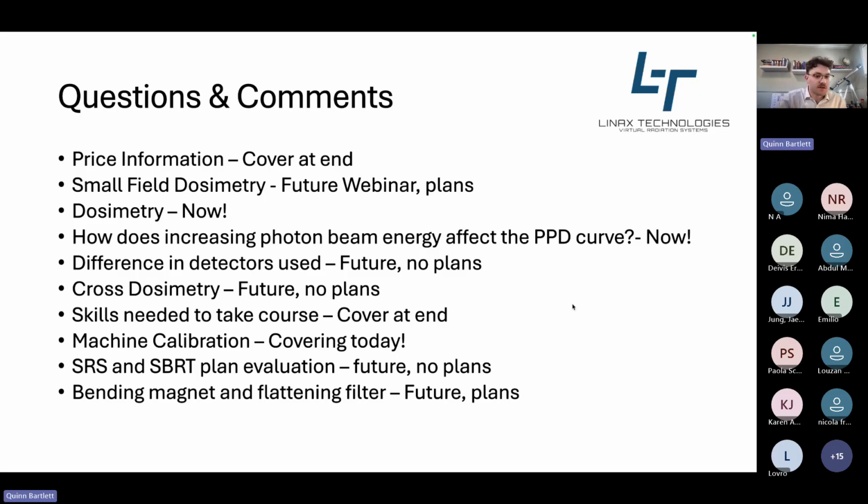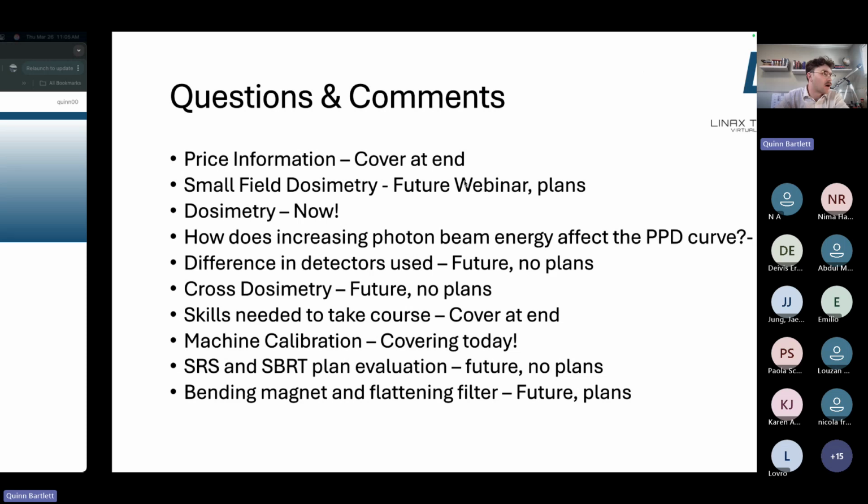Okay, so this is good. But that's pretty much what I wanted to cover before we really get into the demonstration. So let's get over to the platform now.